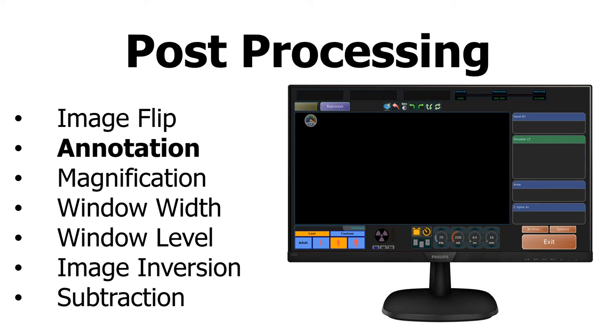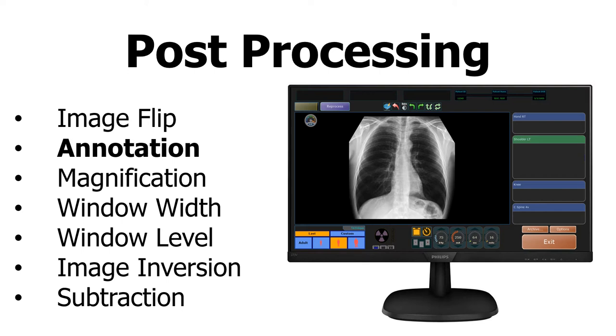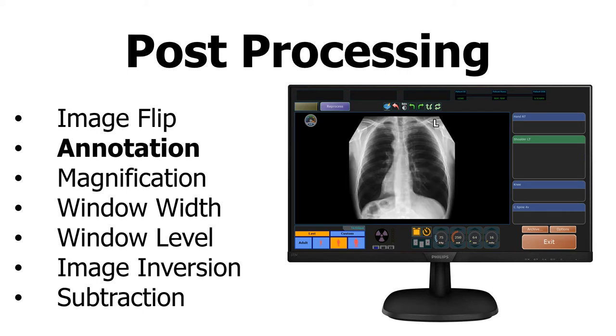For example, you take an image and forget to put on the lead marker. This is what shows up on your screen. Can you identify the patient's left side? If you said this is the patient's left side of the body, then you are incorrect. This patient has dextrocardia, which means the apex of the heart is located on the right side of the body, and the image will need to be flipped horizontally before being sent off to the radiologist.